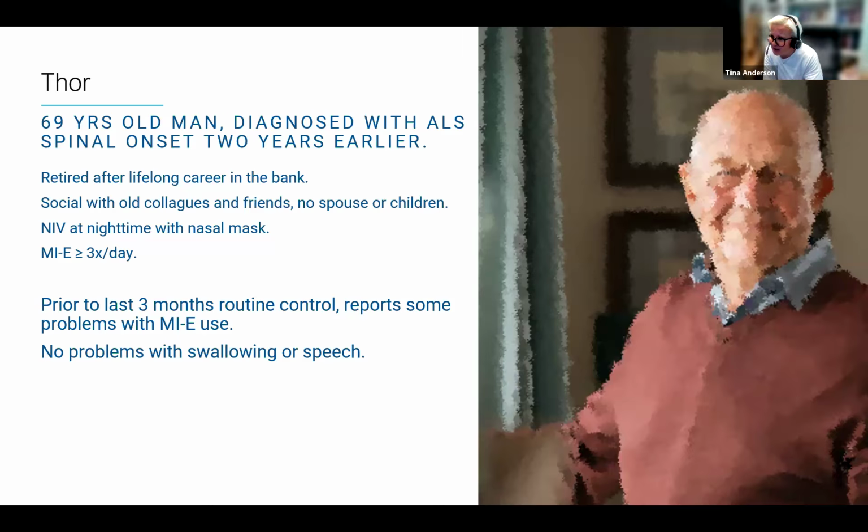He loves to talk on the phone, for instance. He already had nighttime non-invasive ventilation with a nasal mask, and he had already started with MIE 3 times a day to prevent any respiratory infections. And these are based on the measurements we were talking about last week.